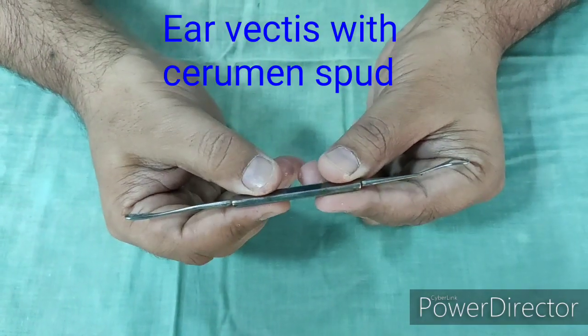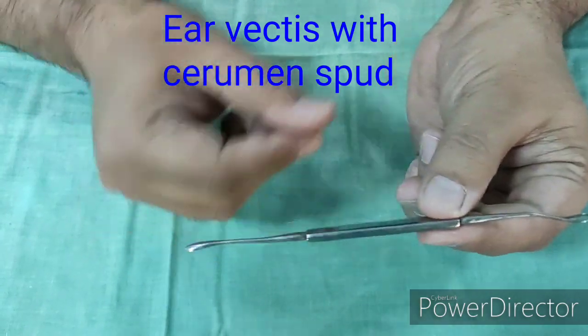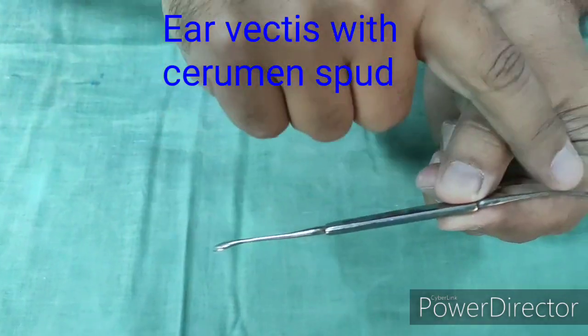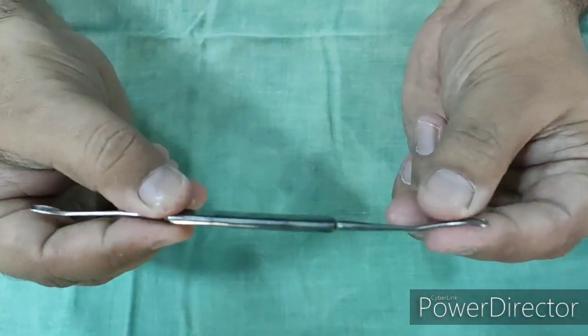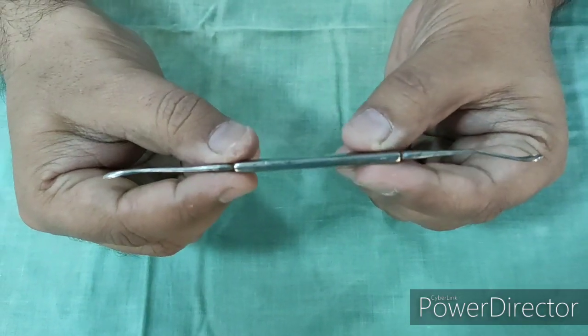This is another instrument used for cleaning of the ear, to remove wax or foreign body. This instrument is called ear vactis with cerumen spud. This ring end is the vactis end, and this is the cerumen spud — it is scoop-like. It has a similar use to remove the wax and foreign body from the ear.